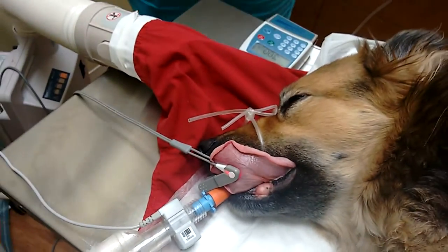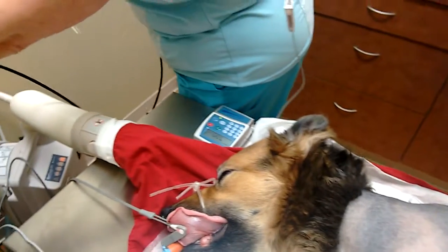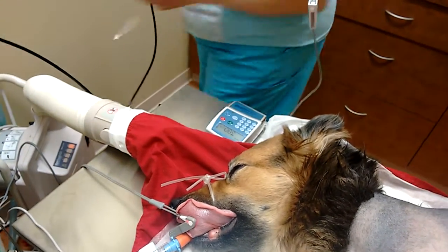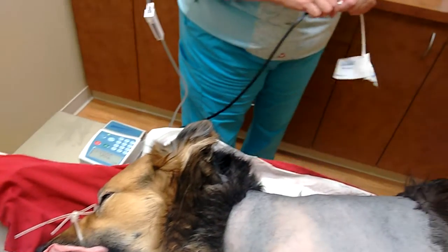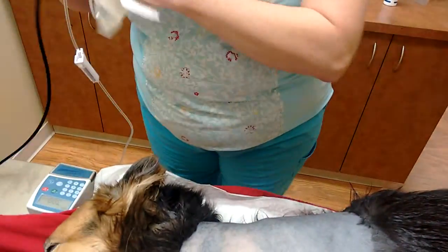The third thing is the cuff to measure blood pressure during surgery. This is a kind of equation used to choose the cuff.